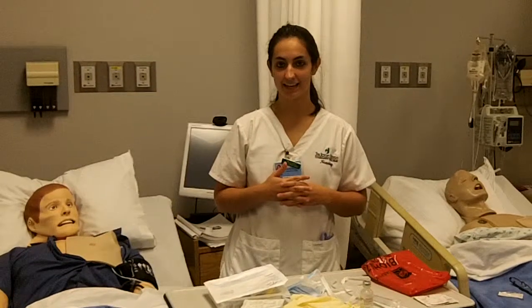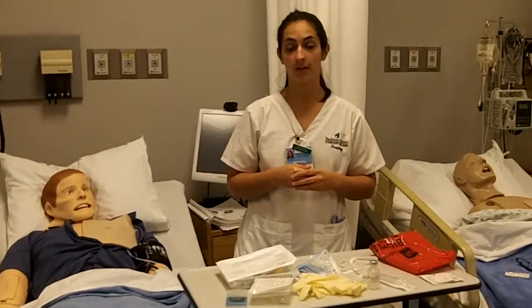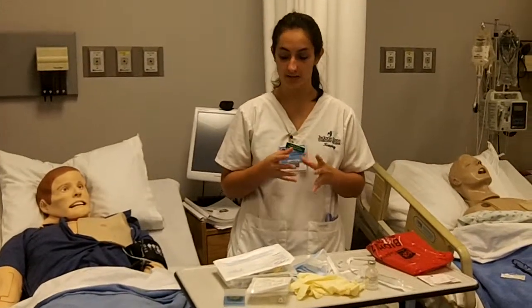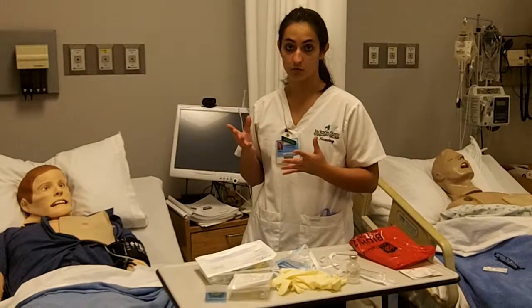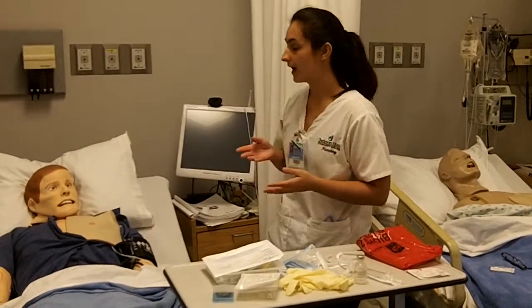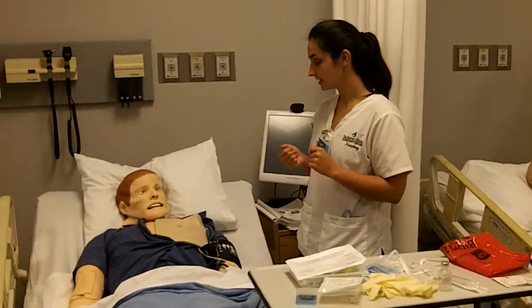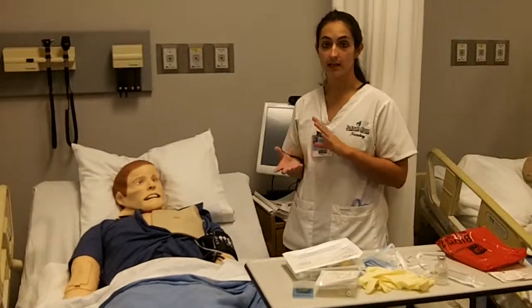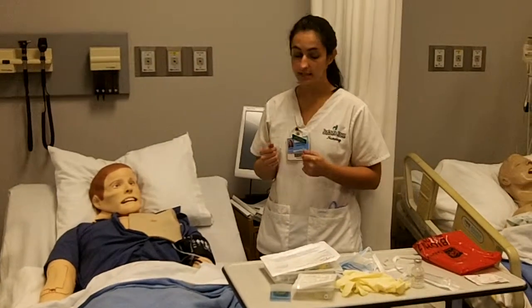I'm Seneca Gaden. I'm a 214 nursing student, and today I'm going to show you how to do a life port access along with a dressing change. So first off, I would check my doctor's order, make sure everything was okay. I would have already washed my hands, come in, introduce myself to the patient, describe the procedure that's going on, and ask him if he has any allergies.